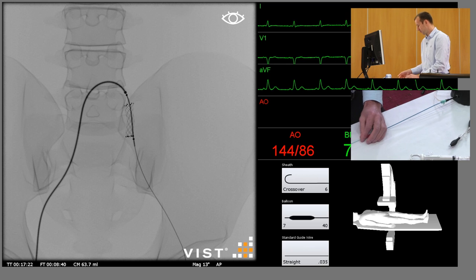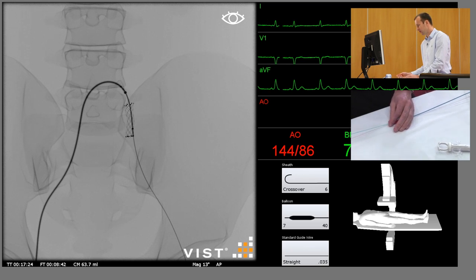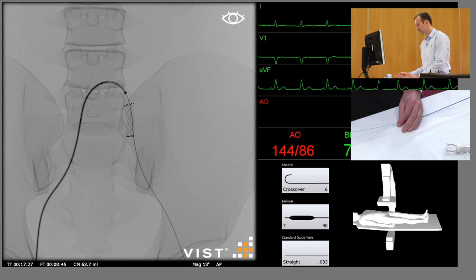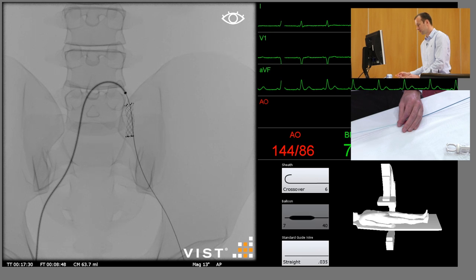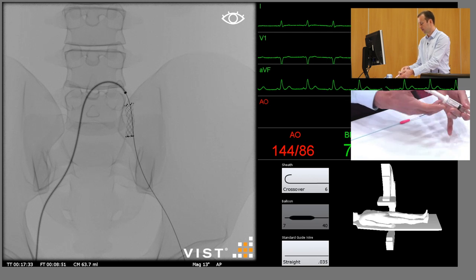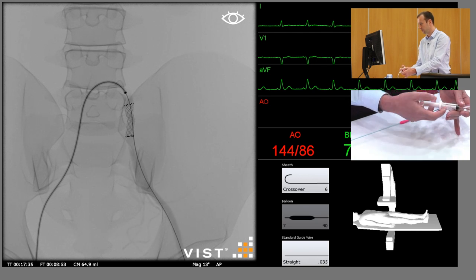Deflate the balloon and remove it, but leave it on the guide wire. And at this stage, do another angiogram through the sheath just to make sure we haven't caused a rupture.